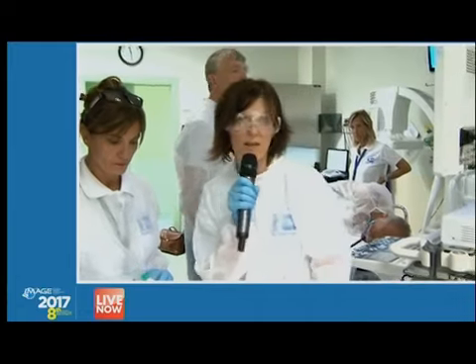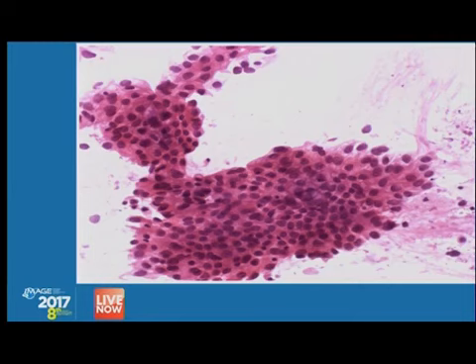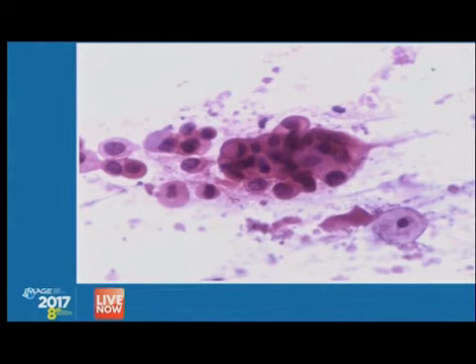On the second slide, you can appreciate a lot of cells. These pathological cells are malignant cells from adenocarcinoma. I hope you can see here. And even in a major enlargement, we can see on the third slide the cells. So you can see pathological adenocarcinomatous cells. So even if this is just a cytological specimen, it's very good for diagnosis.